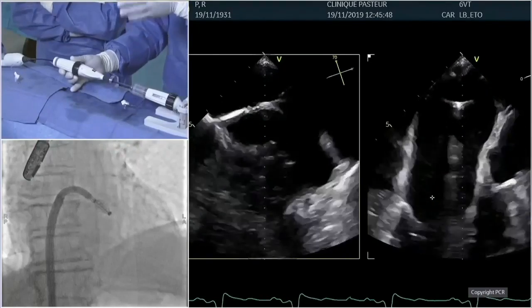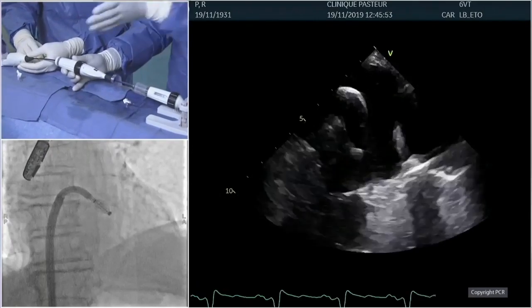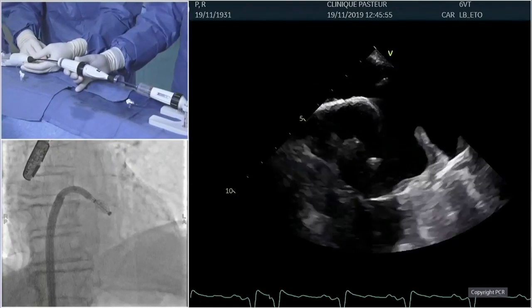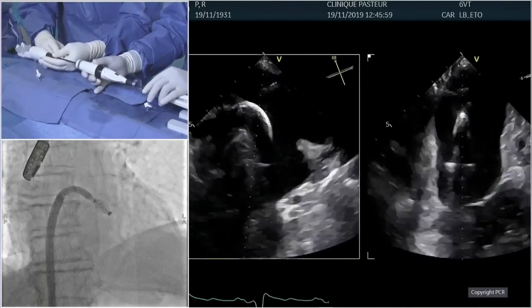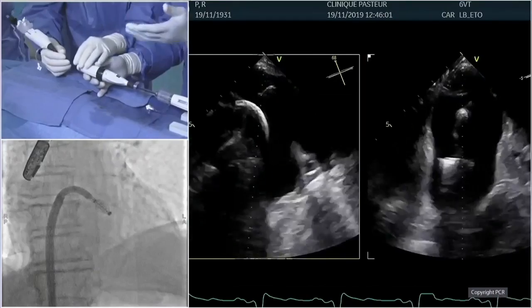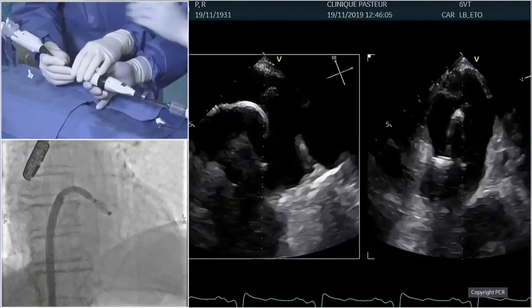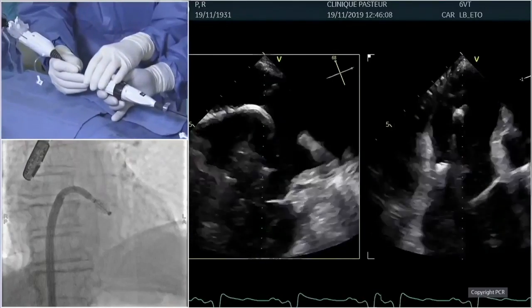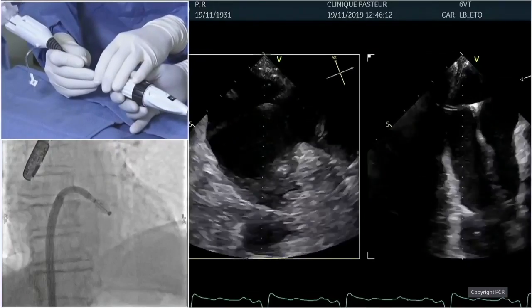So now the idea is to really look at the steerable and the implant and make sure that we are perpendicular. Once we have that perpendicularity, if I want to be more lateral, it will only be about advancing the steerable. If I want to be more medial, it's going to be more retracting it. So Nicolas is going to advance the IC, the implant catheter. Yeah, and we're just going to test our trajectory. Okay, so don't move a little. Okay, I think it's nice.